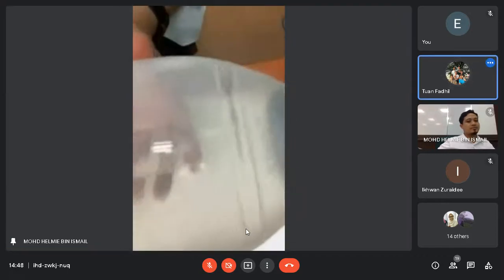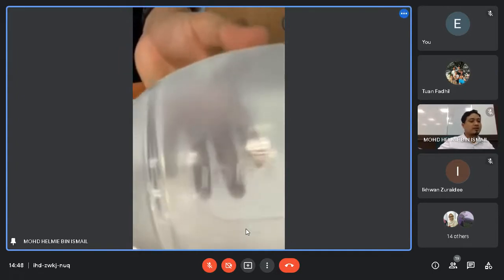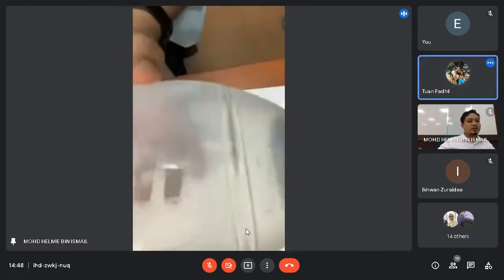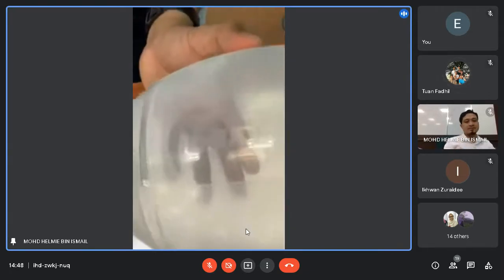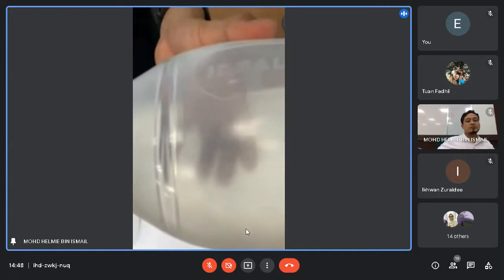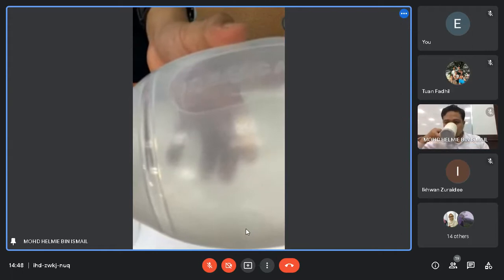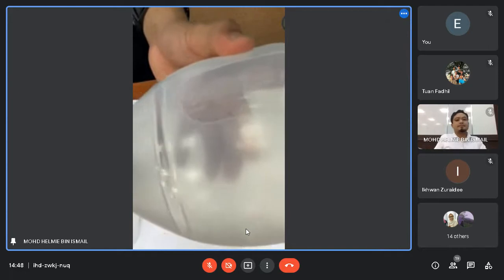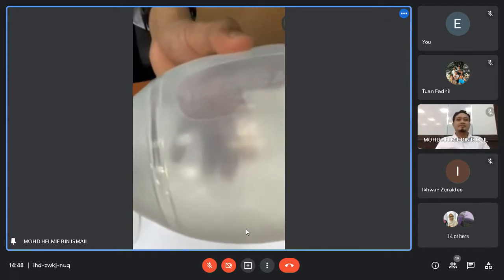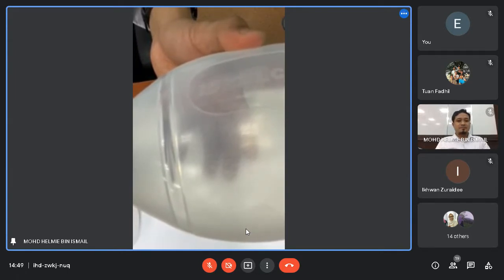Oh, so volume about 1.5 liters. Wow. Alright, 1.5 liters. Yeah. So basically when you bag, kita punya tidal volume berapa? How much? Our tidal volume. Hari tu saya ajar kan ventilator. Tidal volume.